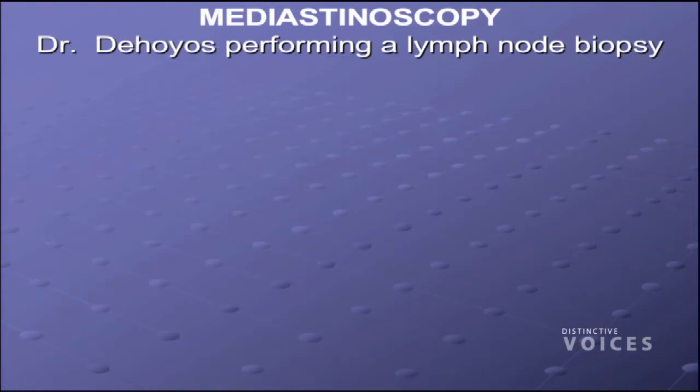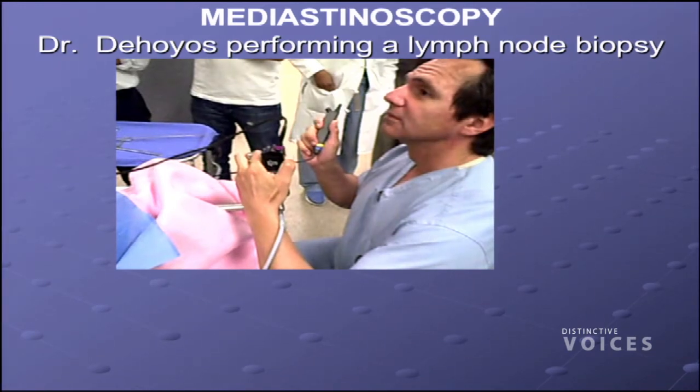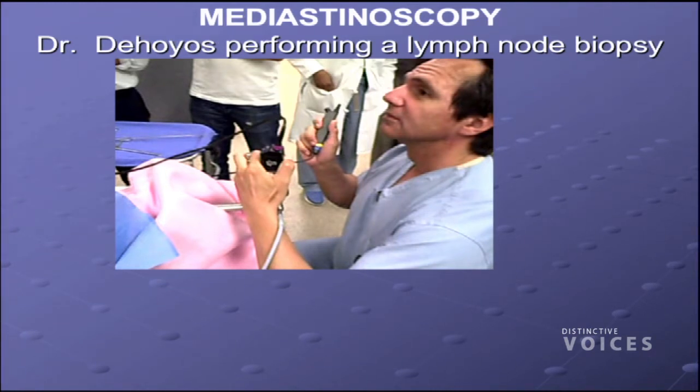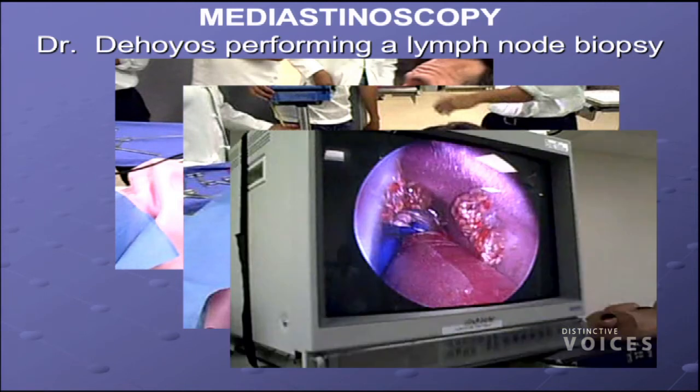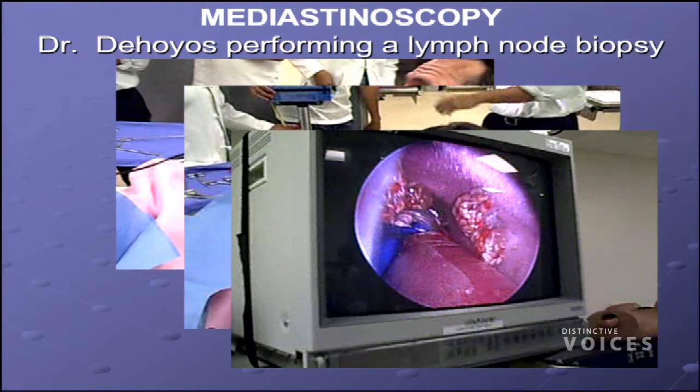This is another simulator, and I wanted to get one procedure that was within a range of surgical techniques that we use. This one's a median mediastinoscopy, and what's fun about this is the surgeon was able to bring his instruments from the operating room and perform a lymph node biopsy. He's looking upwards because this is a video procedure, and he's looking at the screen, and then he looks in directly once he finds a lymph node. This is an inside view from his scope, and we made lymph nodes out of a bunch of different materials, seeds and fake blood and an airway, and the blue thing there is the innominate artery.